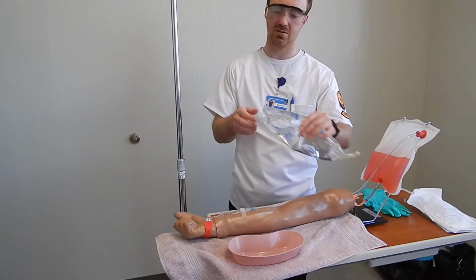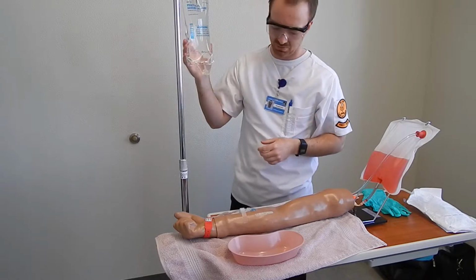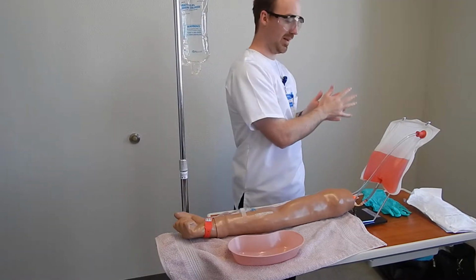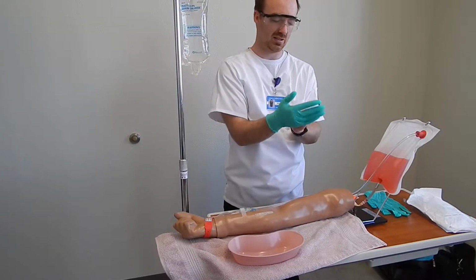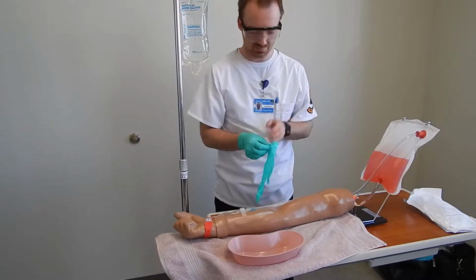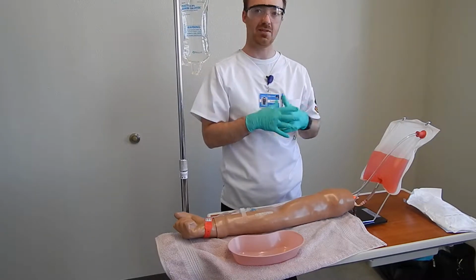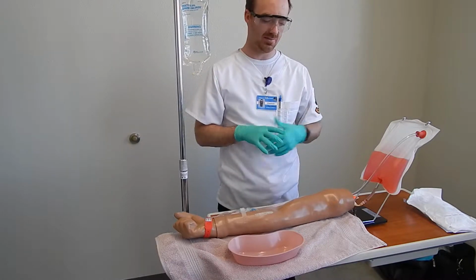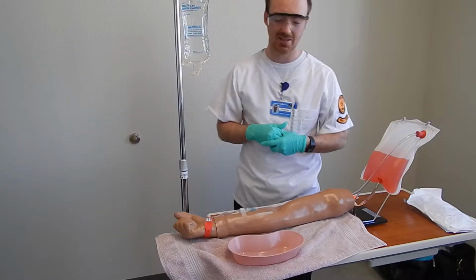Here I have a brand new bag of saline, unopened, unused. I perform hand hygiene upon entering the patient's room. Clean gloves. Go over the 7 rights of medication administration: right route, right patient, right dose, right time.